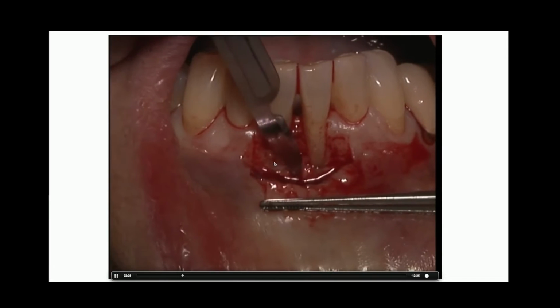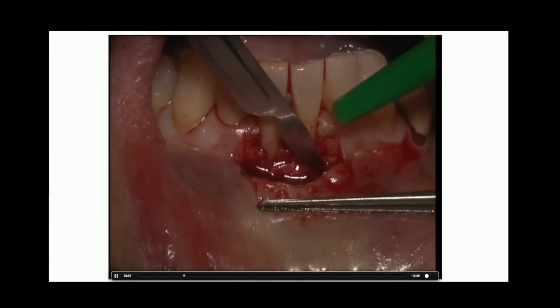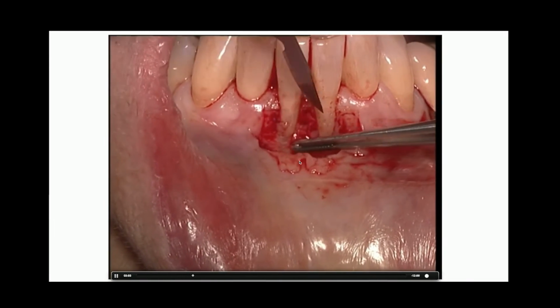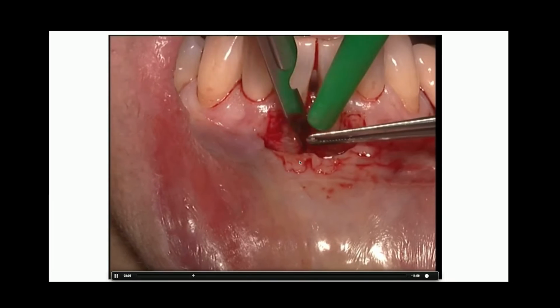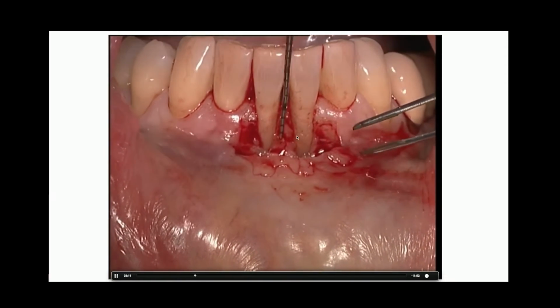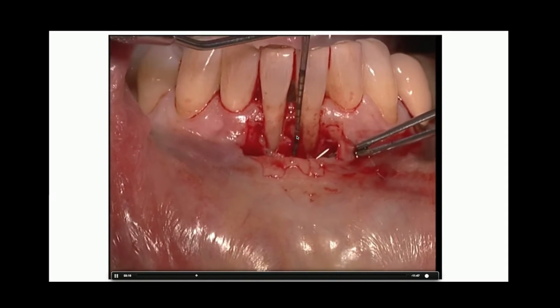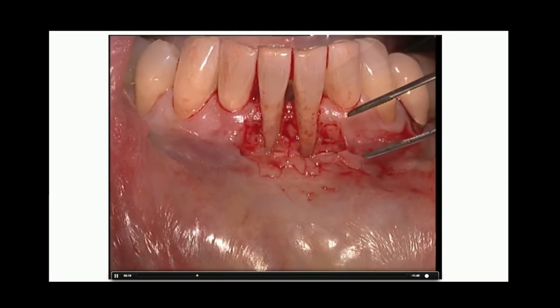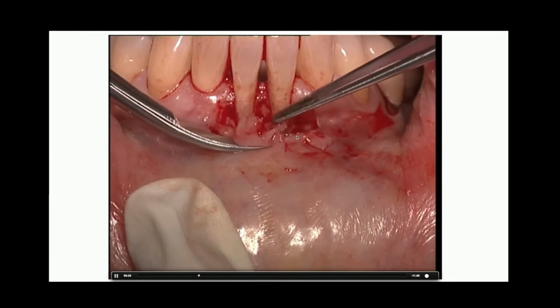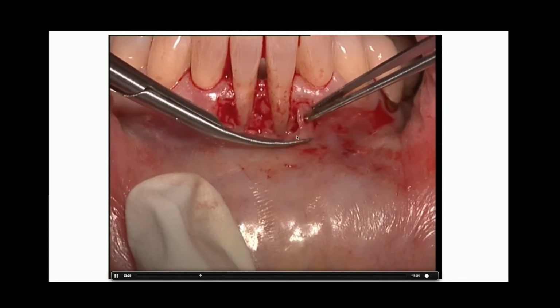So, I can feel very relaxed during this flap elevation as long as I keep the blade parallel to the bone. I remove this muscle insertion because, as I mentioned before, I don't want anything between the periosteum and the flap, since these tissues could destabilize the early vascular anastomosis. So, I really need to ensure as tight an adaptation as possible between the inner part of the graft, the periosteum, and the recipient bed. Now I can trim away my flap.